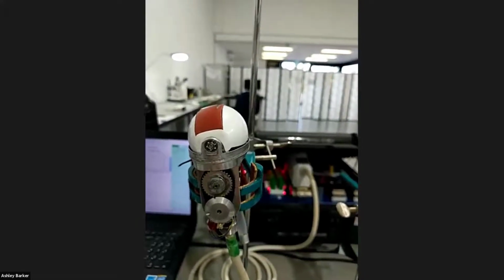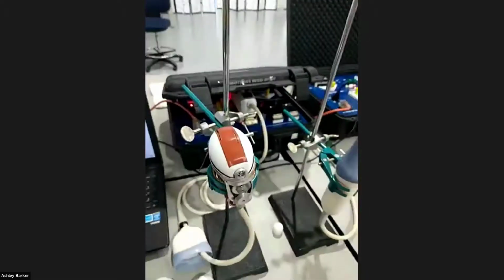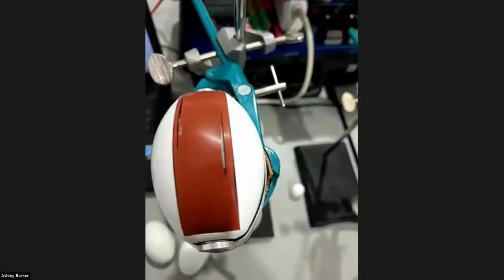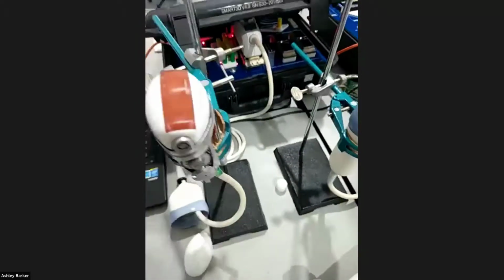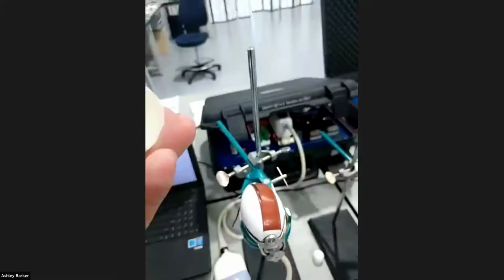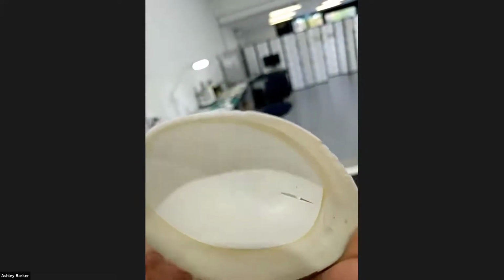It's just a shame that the machine's gone into a different mode. It's moving backwards and forwards, but much slower at the moment. But it will go faster, and if it does, I'll jump back to this to show you. But you can see this normally has a cap that sits over it like that. It's actually very soft if I push my finger on the back.